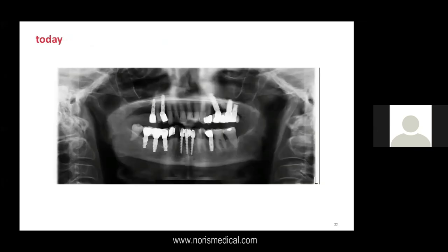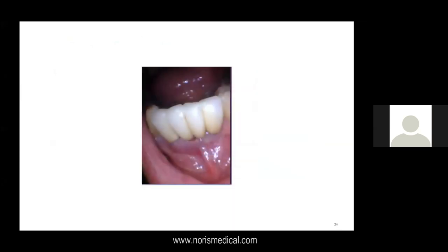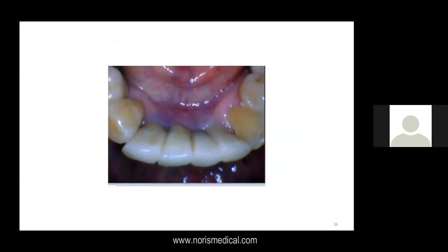A little bit of bone resorption, but actually for more than 16 years, I think that the result is satisfying. So this is how it looks. And this is the bridge. And the reason that the gums are a little bit red is because the patient went with the bridge for 1 or 2 weeks and the bridge was moving. So actually she had a little gum inflammation when she came to me.